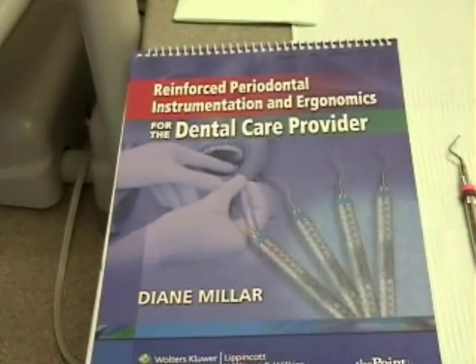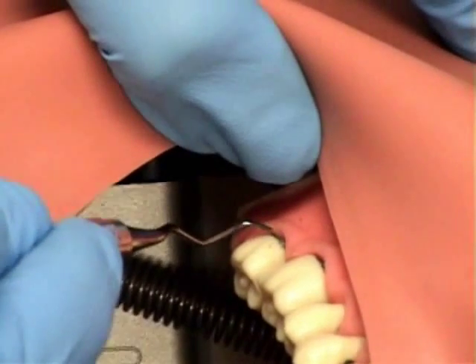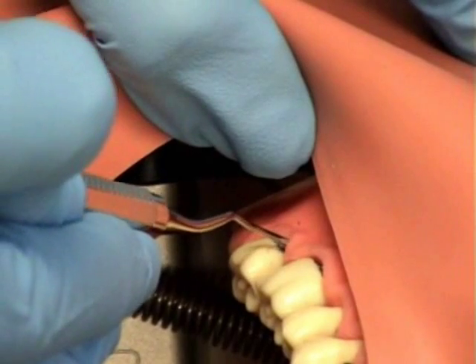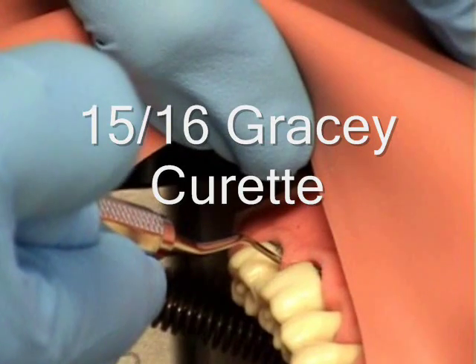To begin, let's review a few of the newer curettes, the 1516 and the 1718. Ms. Johnson will demonstrate the Gracey 1516 on the mesial surface of posterior teeth and the 1718 on the distal surface of posterior teeth. With the 1516, you begin at the distal buccal line angle. Ms. Johnson is working on tooth number 6. She's using the toe third to walk around the tooth surface.